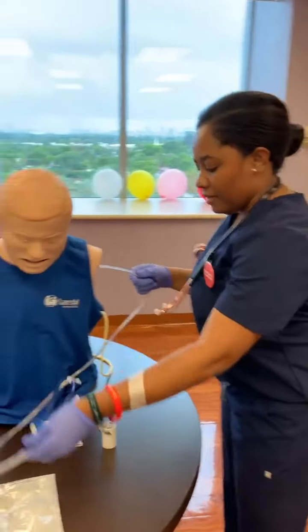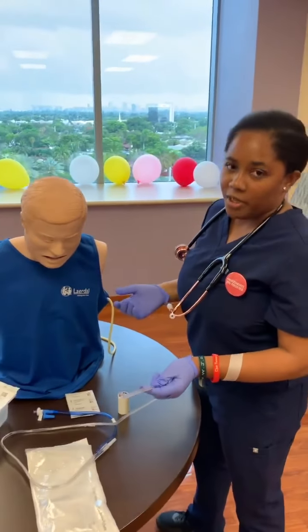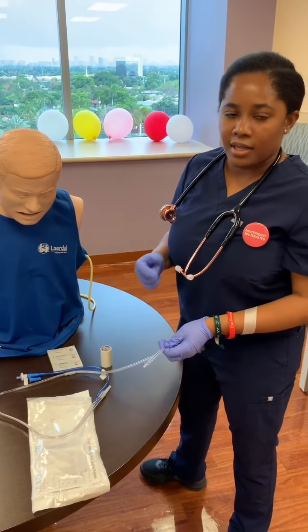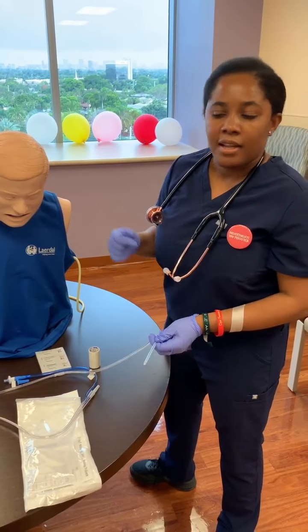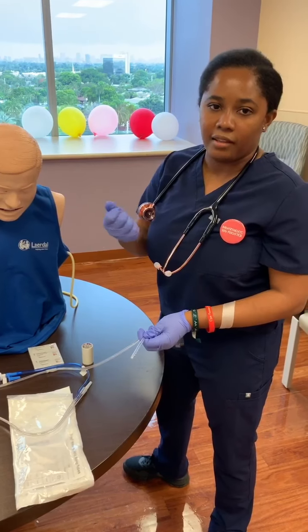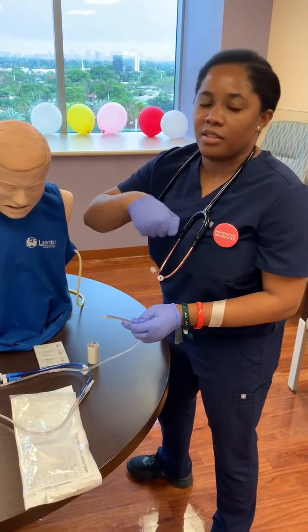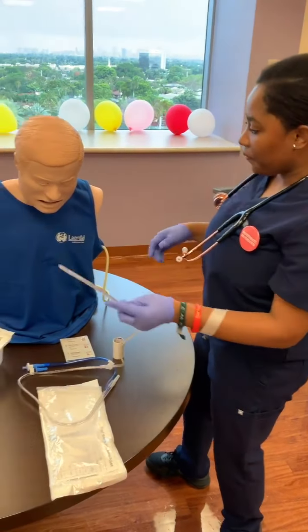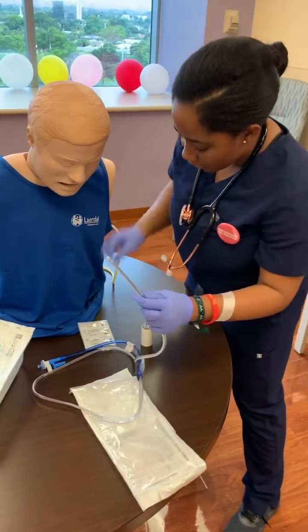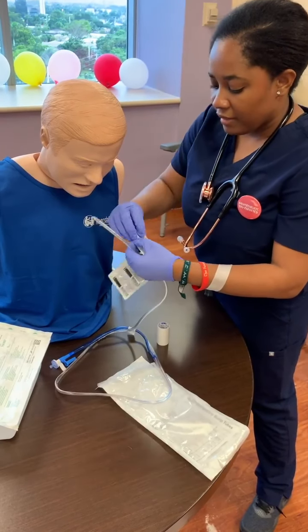So now we're going to be inserting the NG tube. We already told the patient what we're going to be doing. Another thing that I did not mention is if your patient is not NPO and they're able to drink, you can get a cup of water with a straw. When you start to insert the tube, they're able to drink — that way it can help facilitate the tube going down. So we're going to insert it. First, we're going to apply the lube.